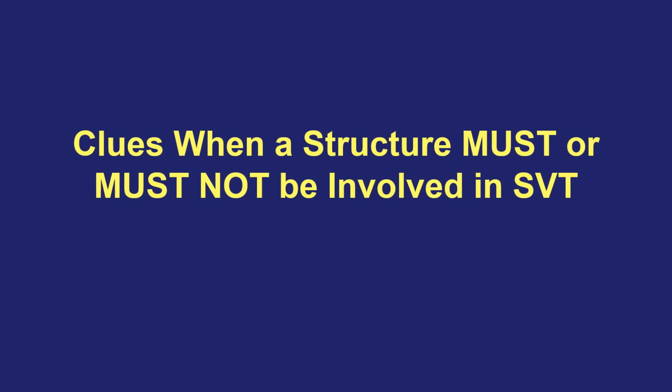The last category of observations that I wanted to review in this SVT presentation has to do with the anatomy of each tachycardia mechanism.